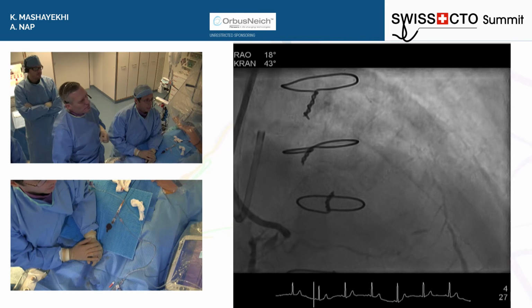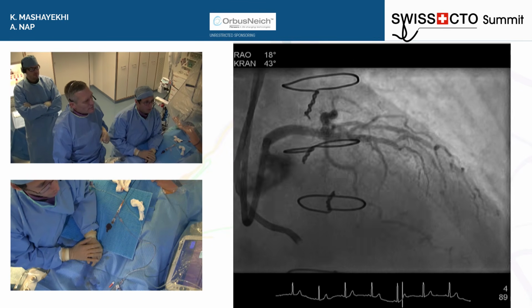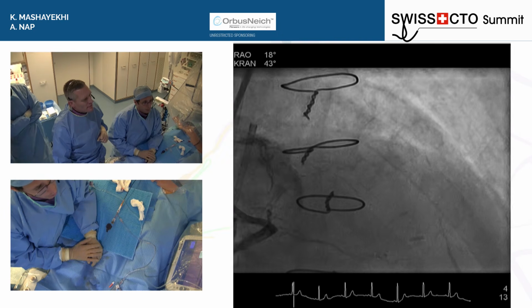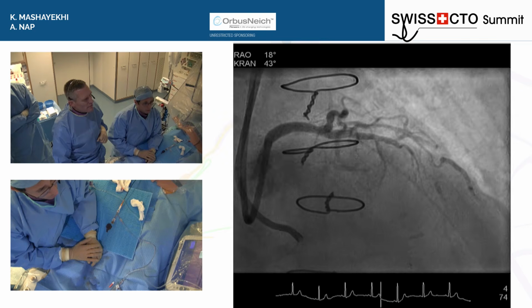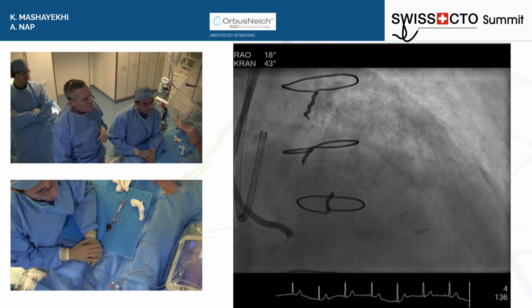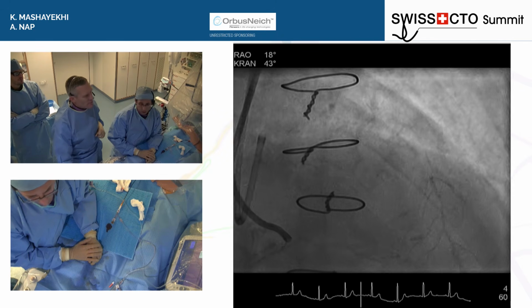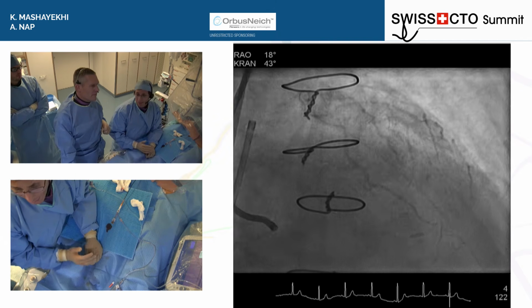I think, first of all, it depends how we fail in antegrade mode. If we are very, very near to the distal cap, then probably sometimes also, to be honest, the parallel wire can be an option. But the other alternative, if we decide for an ADR or Stingray, would be that we convert not too late.